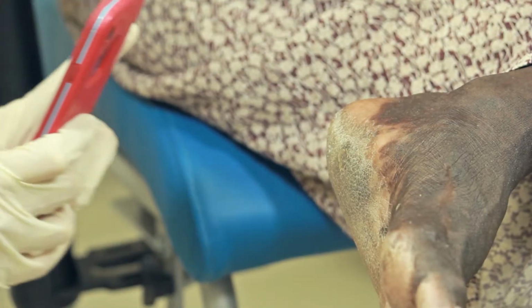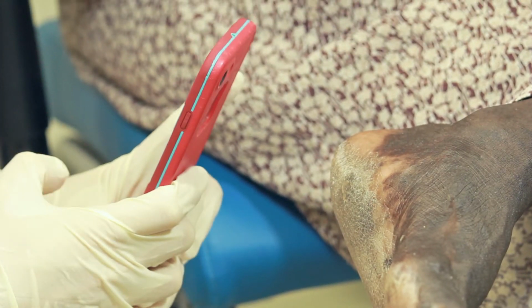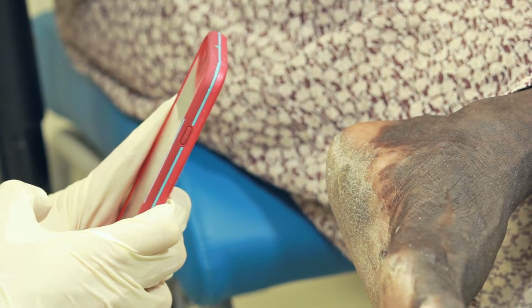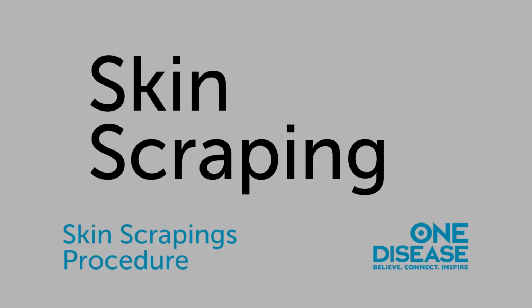In the Northern Territory or other geographically remote areas, a camera is also a beneficial tool. Providing clinical photos of the infested area to your nearest infectious diseases team or dermatologist will assist in both confirming the diagnosis and determining a correct treatment schedule. Handling of images, including storage and sharing, must consider privacy law and strictly follow your organisational policy.